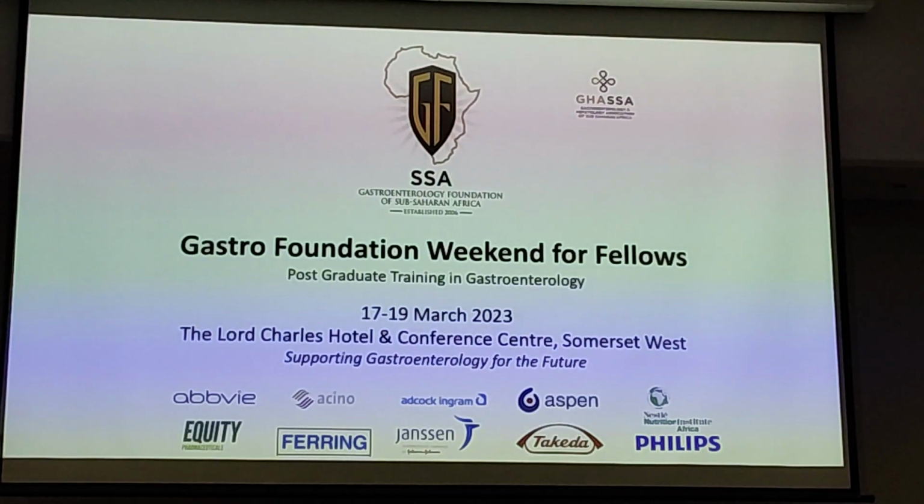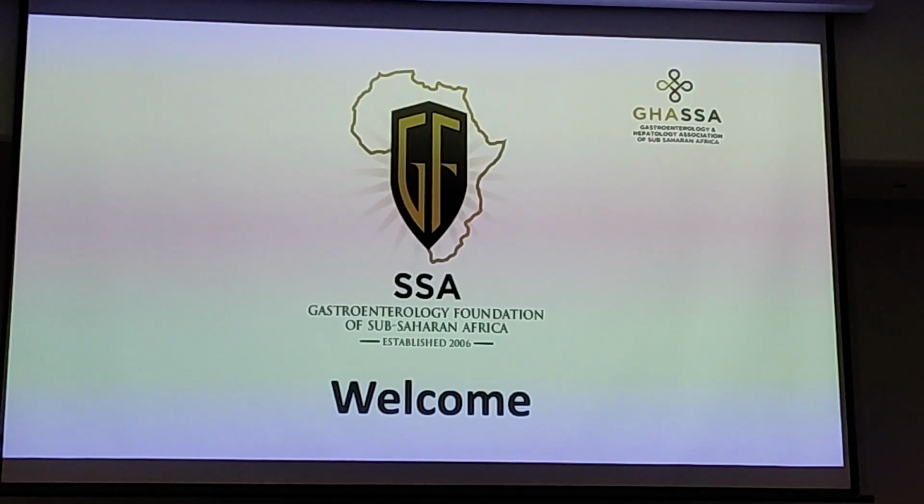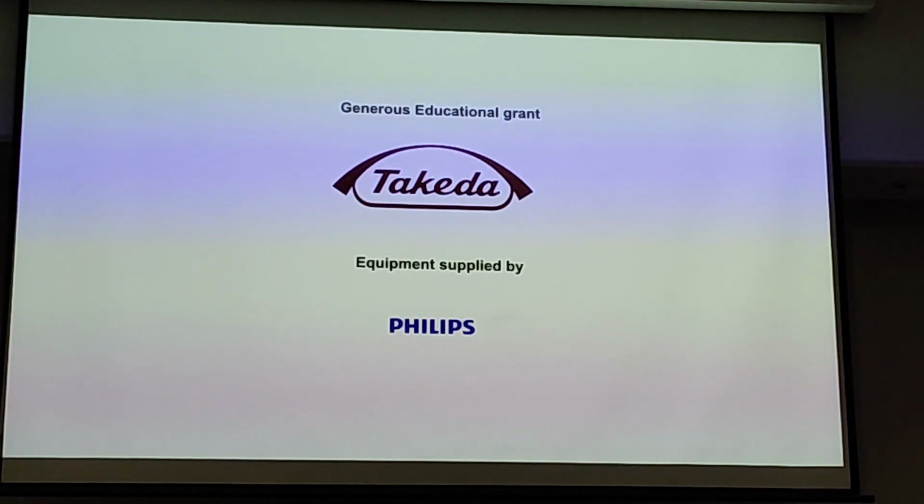And then my second question is around, in our setting, we have lots of tuberculosis, especially in the setting of HIV, which often have disseminated TB. And so have you found ultrasound to be a benefit to somehow differentiating between TB and Crohn's? You did mention it in your talk, but I'm not sure if the literature plays out to that.